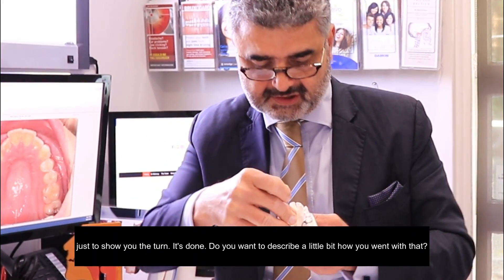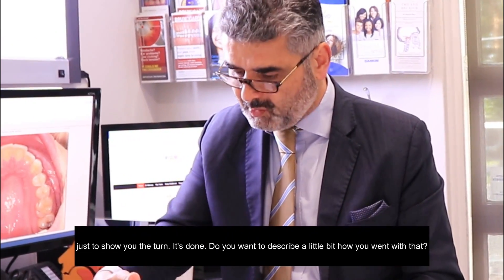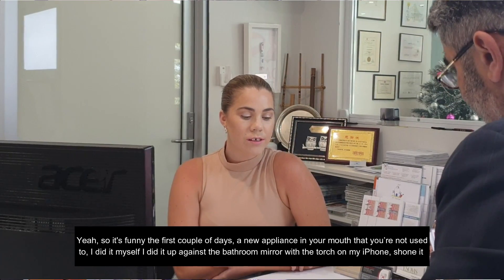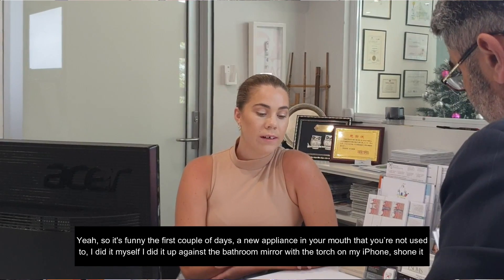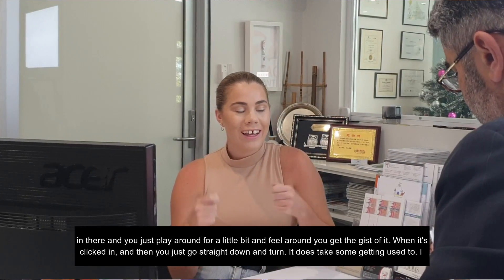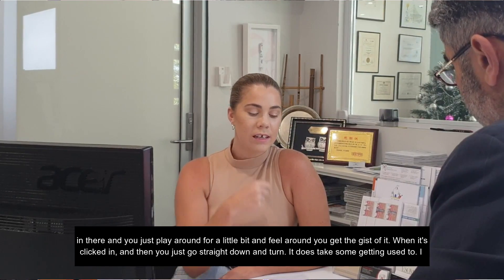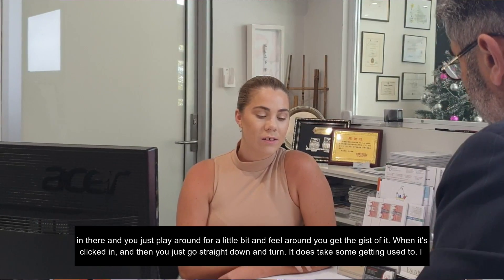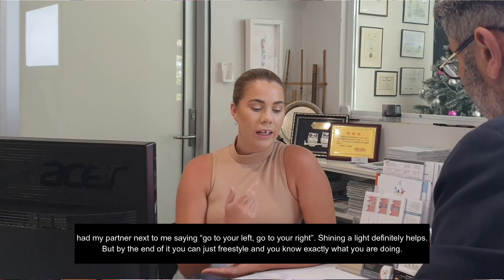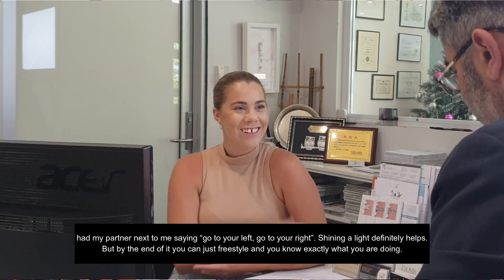So that's just to show you the turn that's done. Can you describe how you went with that? The first couple of days, obviously, there's a new appliance in your mouth that you're not used to. I did it myself — up against the bathroom mirror, put the torch on my iPhone, shone it in there, just played around for a little bit, felt around. You get the gist of it when it's clicked in and then you just go straight down and it's all done. It does take some getting used to — I had my partner next to me saying go left, go right, shining a light in my mouth. But by the end of it, you can just freestyle and you know exactly where you're going.